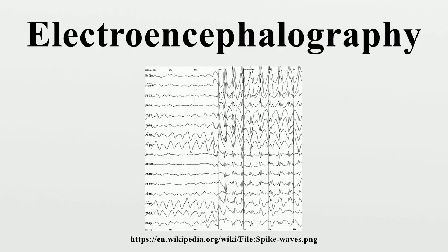At times, a routine EEG is not sufficient, particularly when it is necessary to record a patient while he or she is having a seizure. In this case, the patient may be admitted to the hospital for days or even weeks, while EEG is constantly being recorded. A recording of an actual seizure can give significantly better information about whether or not a spell is an epileptic seizure and the focus in the brain from which the seizure activity emanates.